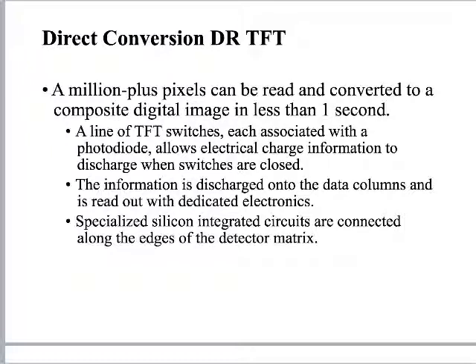So the TFTs basically work like switches. If they get a hit, they're switched on, right? If they don't get a hit, they switch off, right? But this happens very, very rapidly. So they can switch on and then they're read out and then they're switched off very quickly, right? And it's read out in a very orderly fashion. Like this stuff is already organized into its data columns and stuff within the matrix.